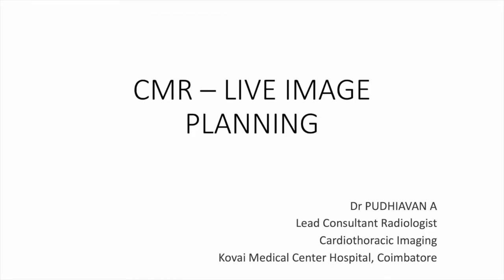Hi everyone, welcome to the CMR Learners series. I am Dr. Pudhiavan, consultant cardiothoracic radiologist at Kovai Medical Center and Hospital, Coimbatore. This session will be on real-time scanning and image planning of cardiac MR.